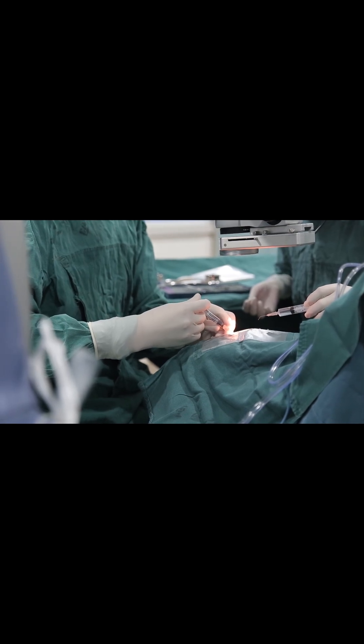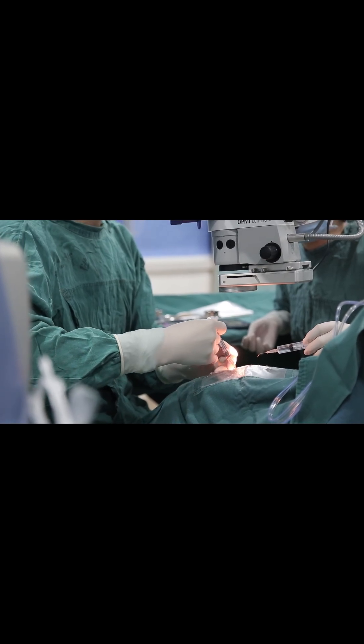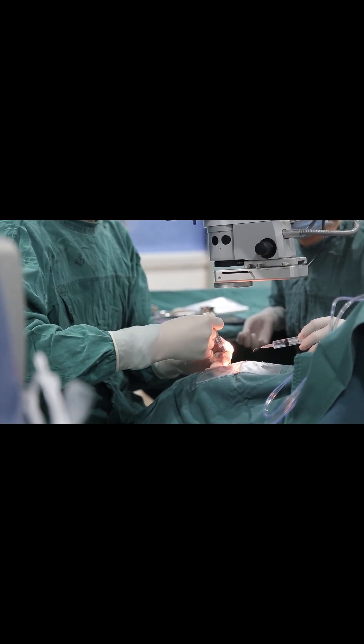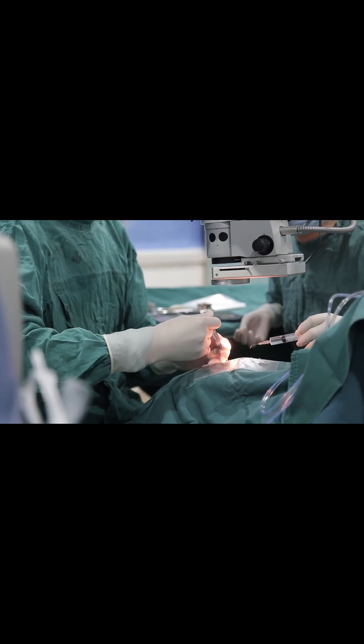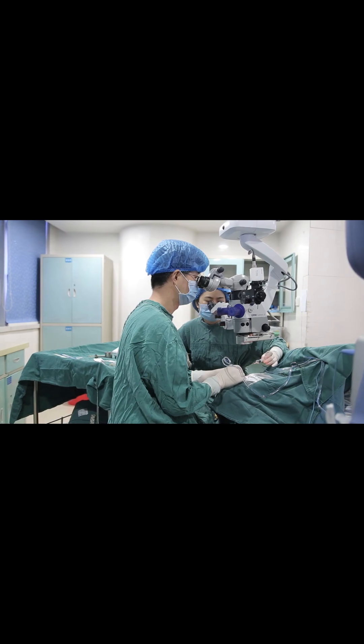Alcohol is sometimes applied to loosen the attachment of the surface cells from the rest of the cornea. The diseased cells are then removed with a blade or brush. Occasionally, another instrument is used to polish the surface of the cornea.